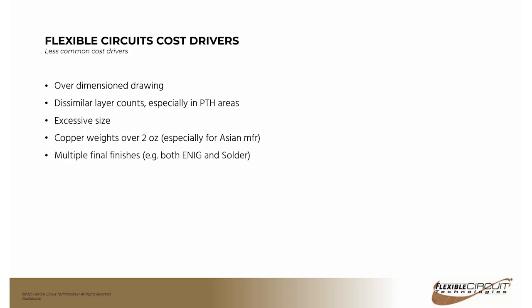ENIG is pretty much the standard of the industry that we're seeing. If that doesn't meet your needs because you're doing wire bonding or something, you can look at things like ENEPIG as an alternative, which will give you a few more options and isn't a huge cost driver.